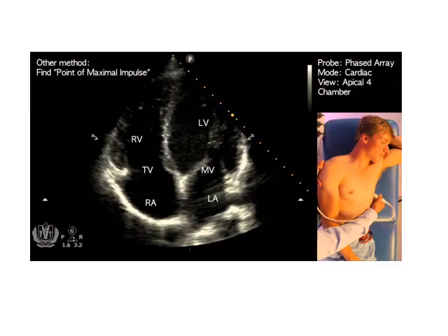Anyway, this is what it looks like when you're getting it done. This is the mitral valve in here, and here's your tricuspid valve. It doesn't quite look like this, though, because you're in a darkened room. When I had it done, the technician was on this side and the screen was up here, so you could watch it as well. They're doing the ultrasound up through the bottom. So here's the skin on this part, and then you're looking up through the heart, through the middle.